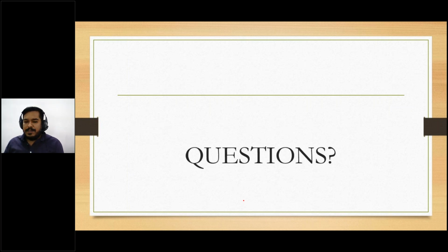The question is from Professor Arun Kumar Chatterjee, who asks, is the term entropy that you have used the same as the one you defined in thermodynamics? No, it is Shannon entropy. For finding out the formula of mutual information that we are using, the entropy that we are using for measuring the image matching is called Shannon entropy. Okay, but I believe the term entropy comes from the same meaning, disorder. Definitely, I believe it's the same.